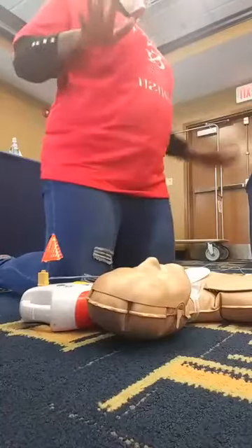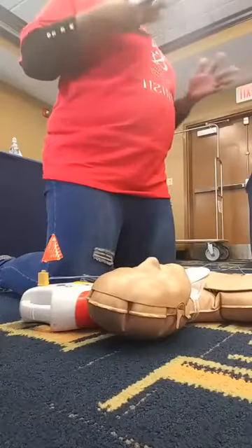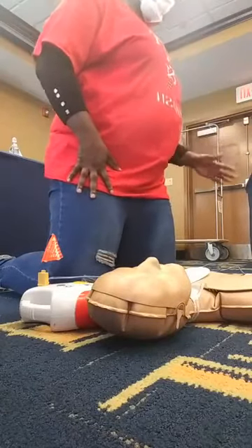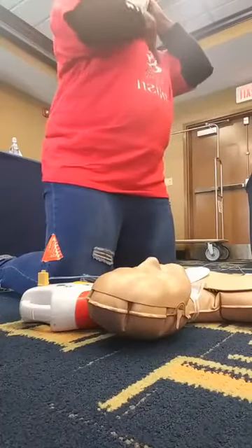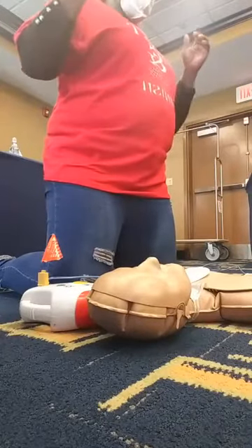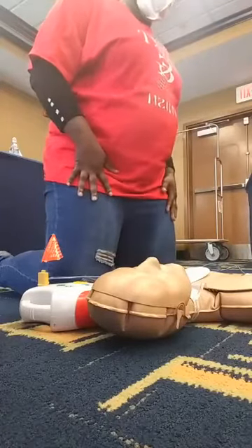There are a few considerations with the AED. One, it is safe to use on a pregnant lady. If a victim has been submerged in water, you do want to get them out of the water and dry off, more so the chest area. You don't have to dry off the rest of the body, just the chest area where you're going to place the pads, because water and electricity don't mix and it can interfere with delivering a shock.